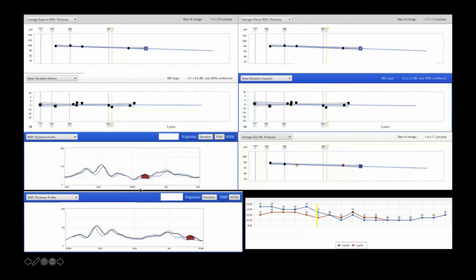One of the other things that I think is really important when we're looking at this is that we've had these recurrent Drance hemorrhages over time. We've had progression. We can see the change over time, but we don't see it very significantly. It's only popping up at the very, very last visit showing that there's significance there. And so we have progression, but the progression is in the green. And so that's really important for us to take a look at and keep in mind when we're going through the patient.